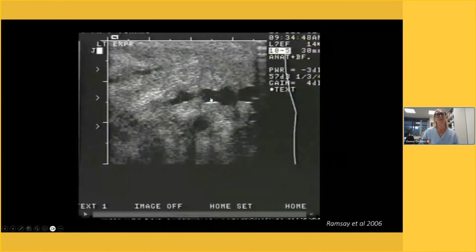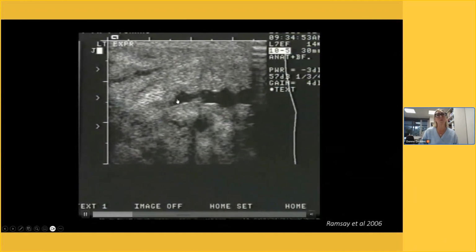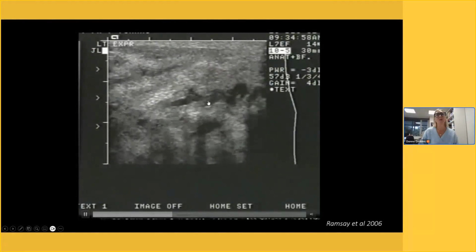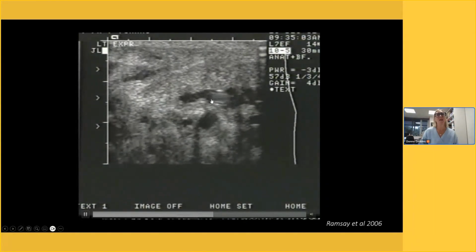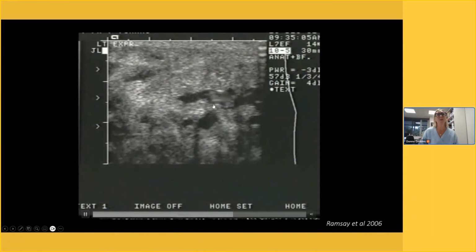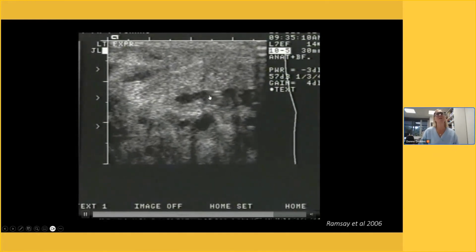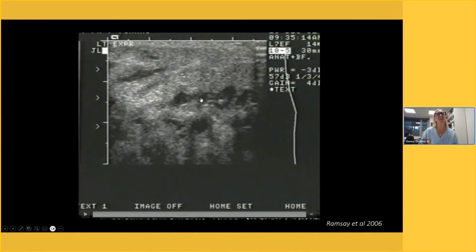This mother has small milk ducts. You can see very clearly here that they're much smaller. You'll be able to see the milk start to flow. It seems a little slower. It's much brighter, so it's likely got more fat in it. We have a very small dilation of the ducts. Hence, this mother's anatomy and her milk ejection means she's likely to express less milk than the other mothers that you've seen during the milk ejection.